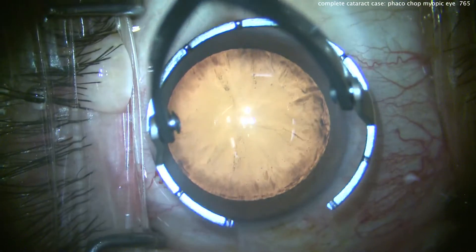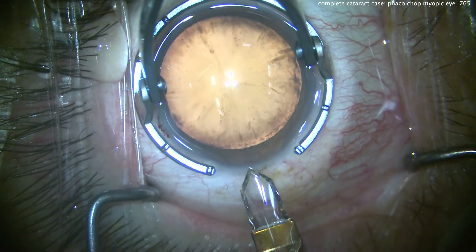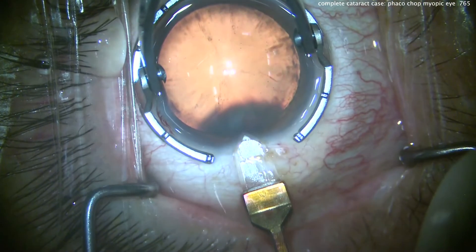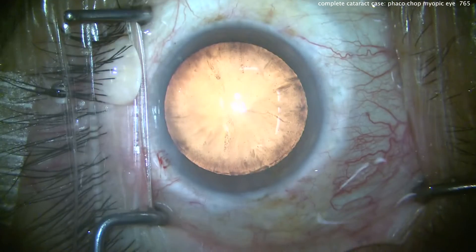We'll make our incision. Compare the cornea to the fixation ring — that's a big cornea. We'll use our diamond here to create a temporal incision. We're making that on the steep meridian to help the patient's astigmatic result.